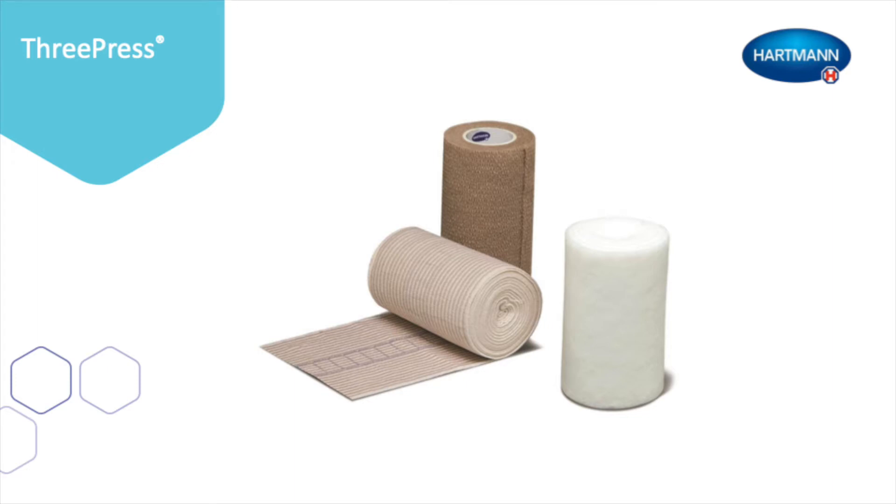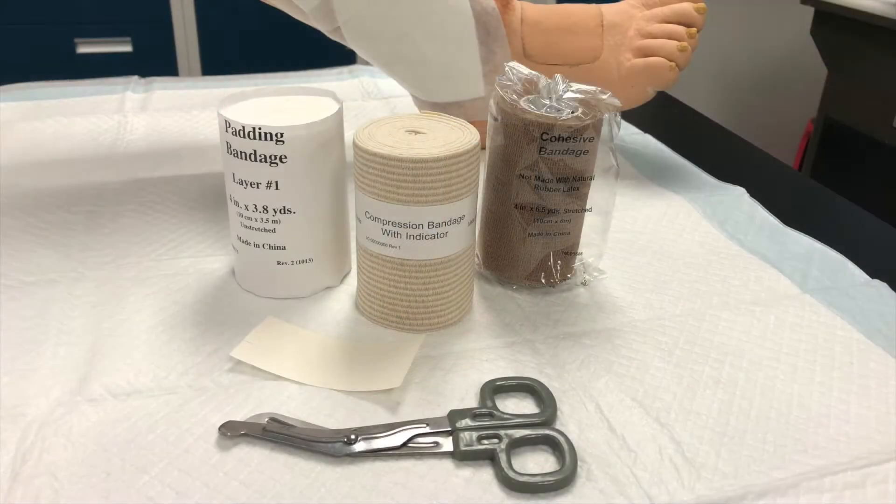3Press is a three-component compression system consisting of a padding, a compression, and a cohesive bandage layer. The 3Press compression bandaging system is indicated for the management of venous leg ulcers in related conditions.